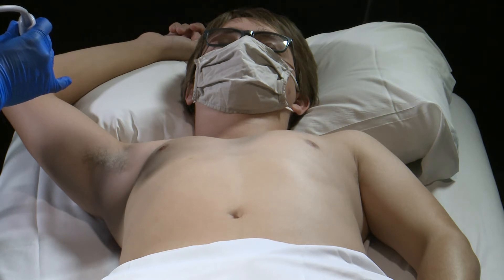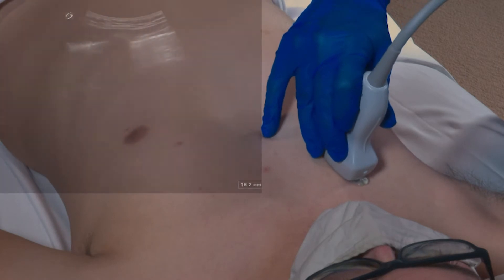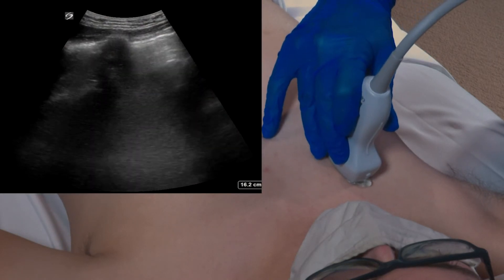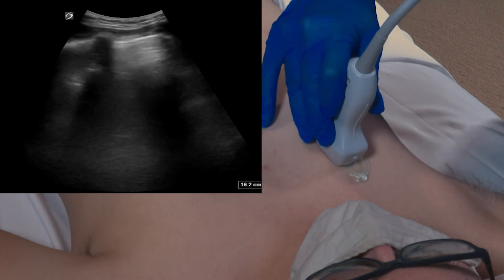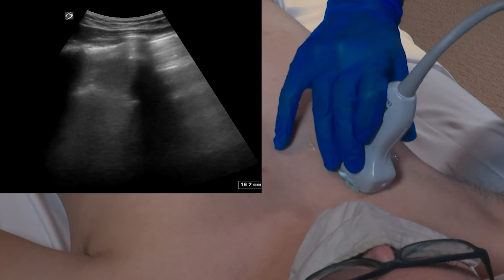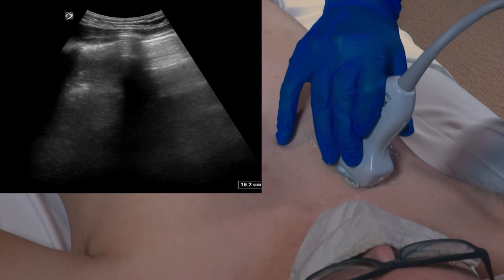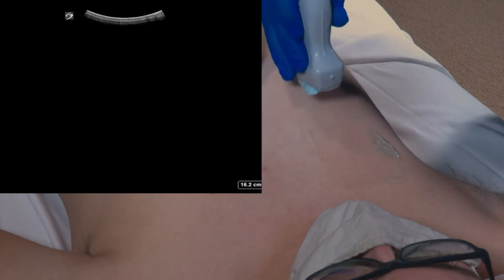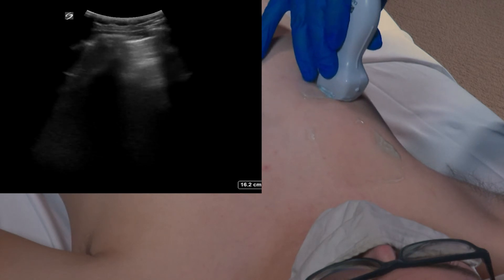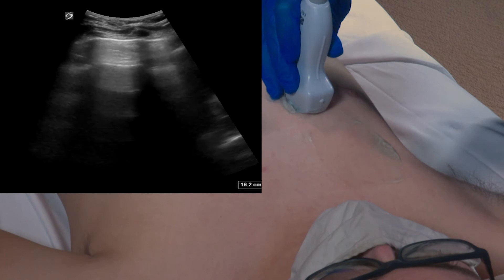We are going to start on the right side in Zone 1, which is the anterior superior zone. Our machine needs to have a depth setting between 12 and 16 centimeters, and we are going to put the probe on the chest wall and move the transducer throughout Zone 1 looking for any evidence of B lines. Next we are going to move into Zone 2, the anterior inferior zone, and again move the transducer throughout that zone looking for any evidence of B lines.